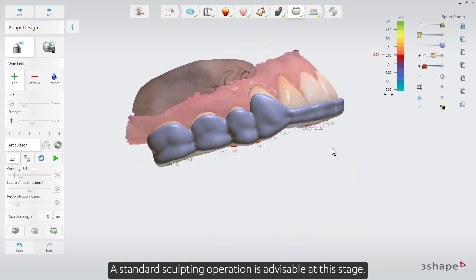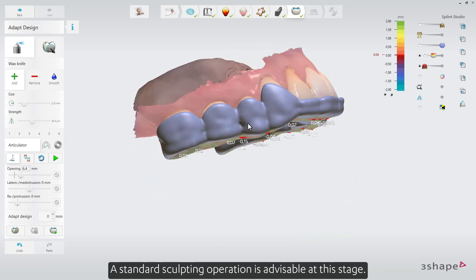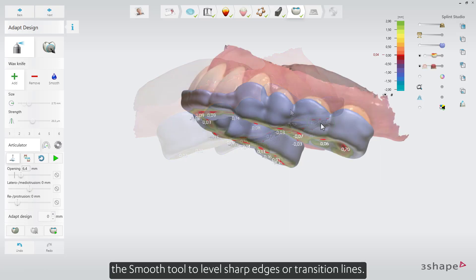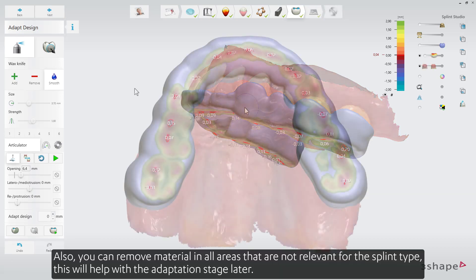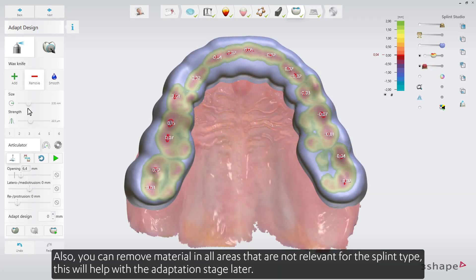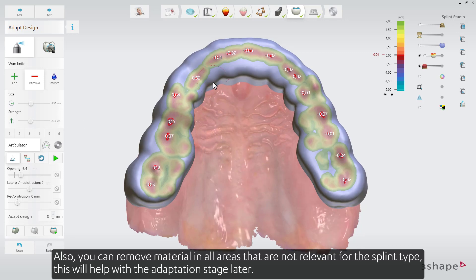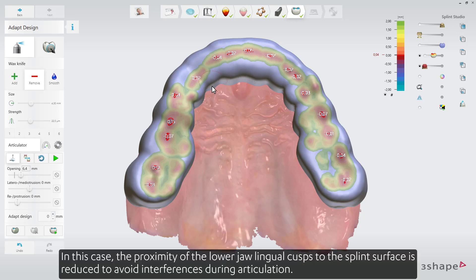A standard sculpting operation is advisable at this stage. Use the smooth tool to level sharp edges or transition lines. You can also remove material in all areas that are not relevant for the splint type — this will help with the adaptation stage later. In this case, the proximity of the lower jaw lingual cusps to the splint surface is reduced to avoid interferences during articulation.